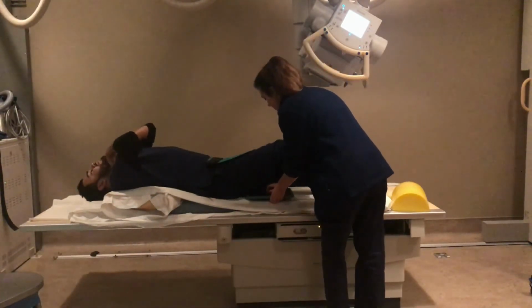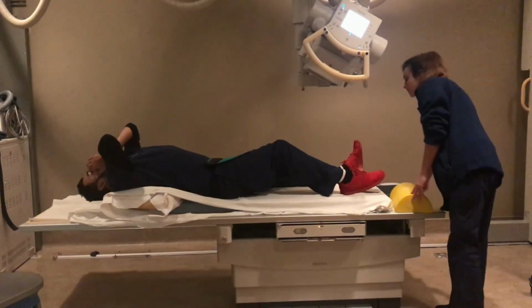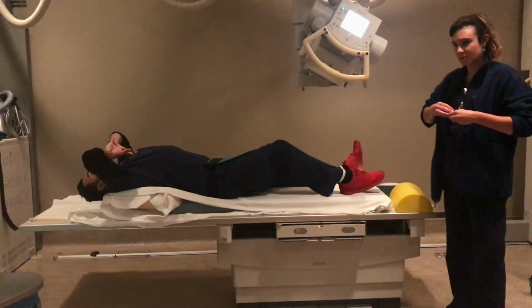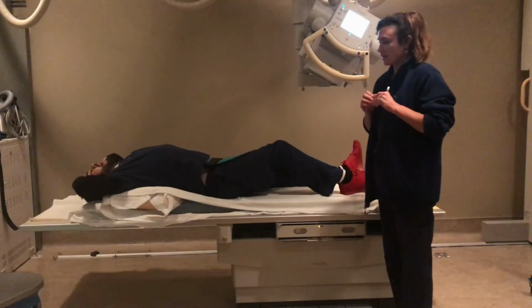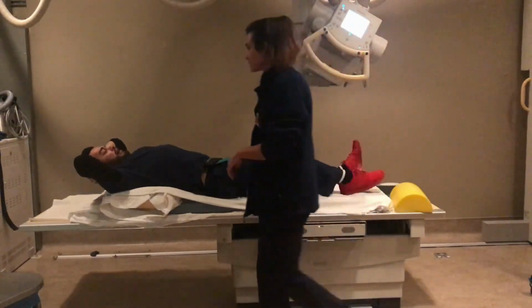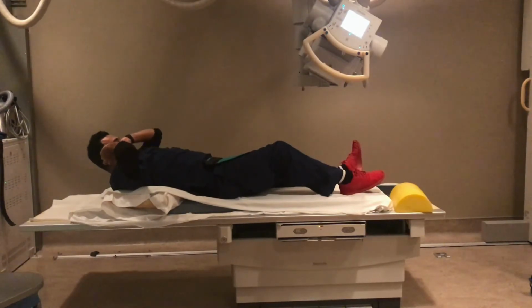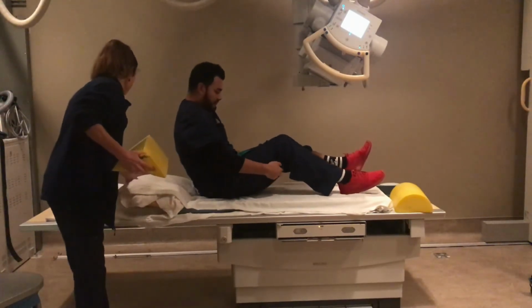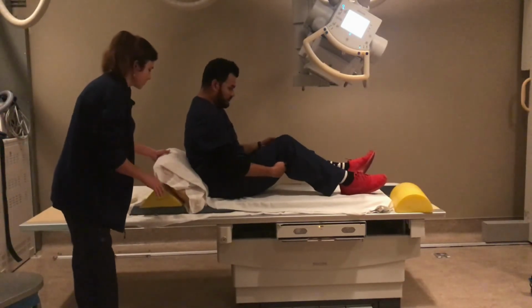Okay, so the next picture is going to be the tangential projection of the patella, and we're gonna do the Settegast method of him holding the IR above his knee. So let me go ahead and put a sponge behind you here. Just gonna have you sit up. Alright, you can lean back a little bit.